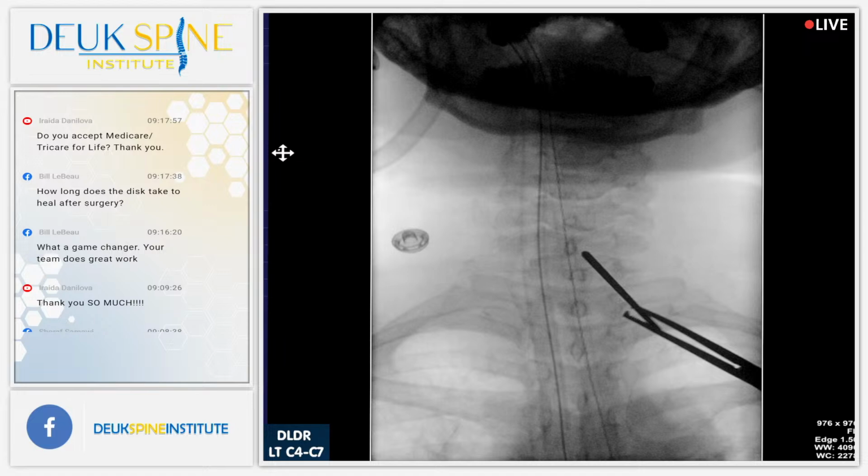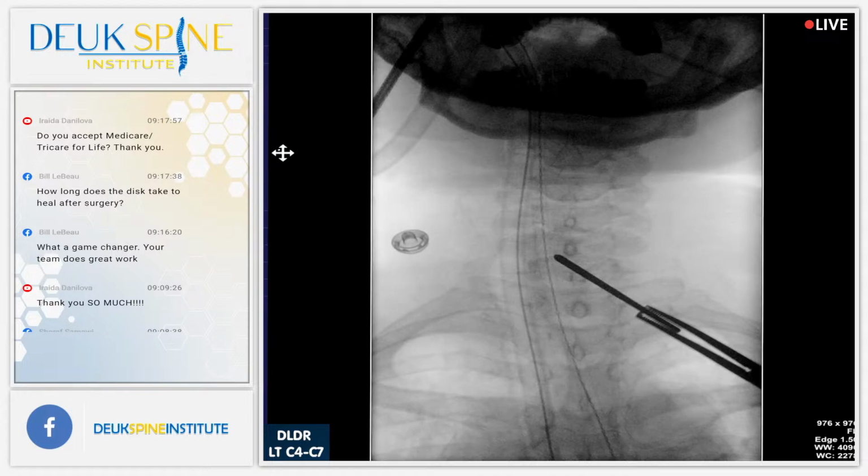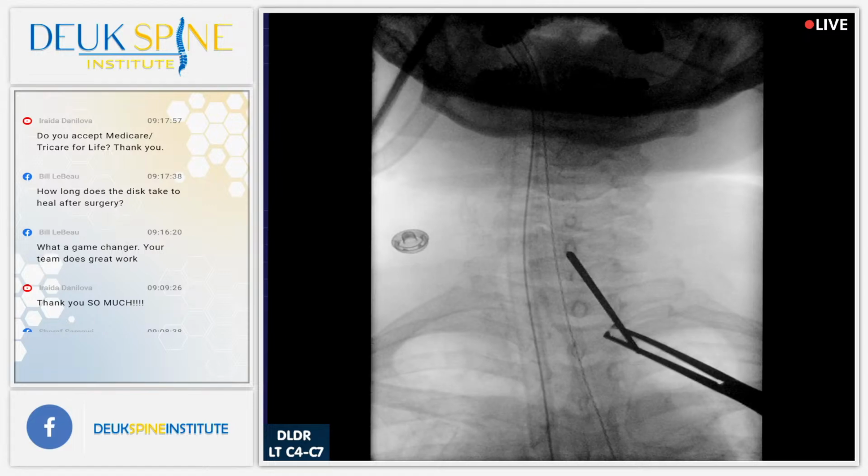I have to stay on the vertebral body. That did not feel like it moved. Oh, it did. All right. Well, I moved a little too much. So how about that? That's perfect. See how the tip of the dilator is right where the spinous process is? Jordan, show them. The tip of the dilator is sitting on the front of the spine, dead center, right there. Okay, as long as you're lining up with the spinous process, you're fine.